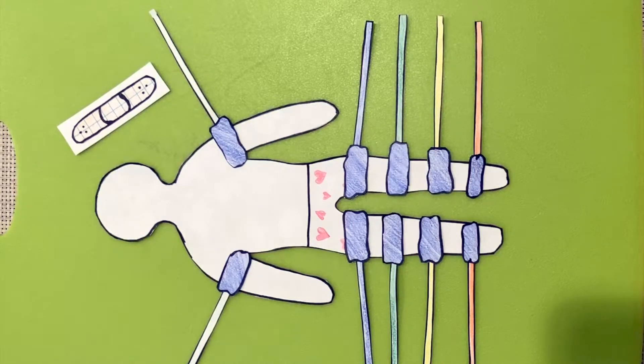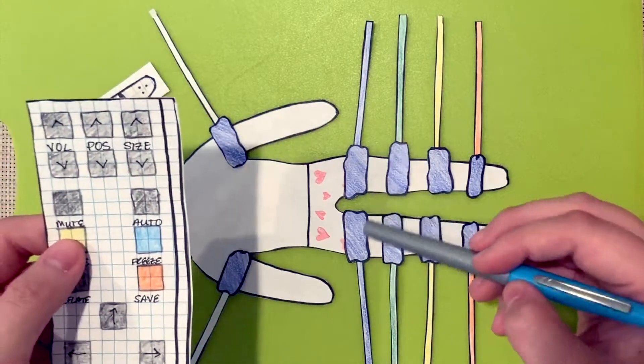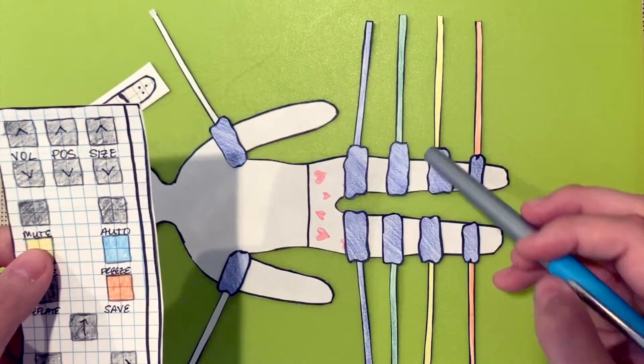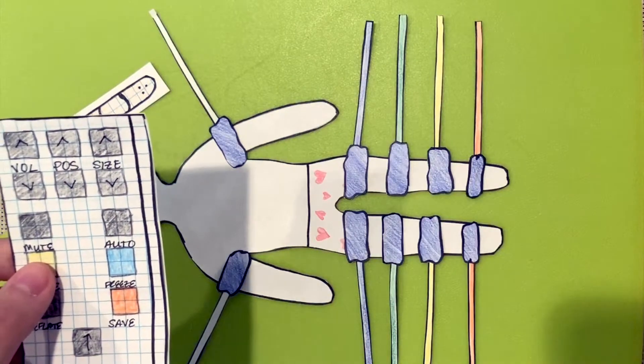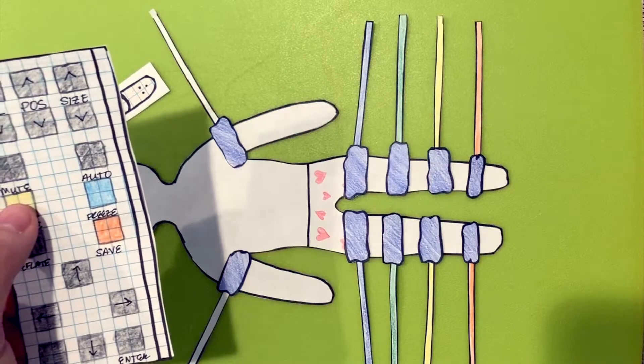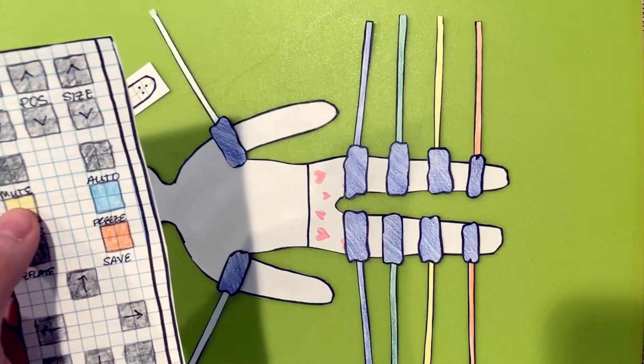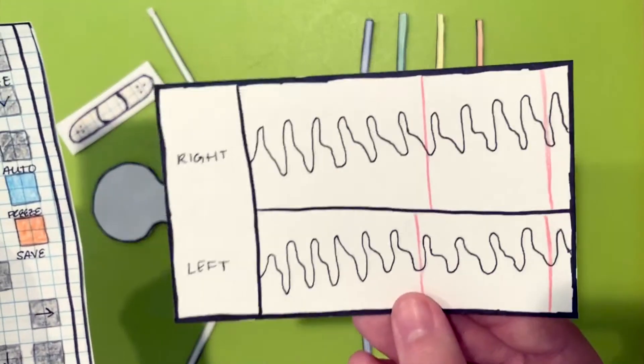PVRs record the change in limb volume related to each cardiac cycle. The pressure cuffs will stay on and the remote will be used to inflate the cuffs. The cuffs will inflate sequentially at a lower pressure from the top of the thigh to the ankles or the toes. While the cuffs are inflating, a waveform will appear on the screen. Wait for the waveform to stabilize.